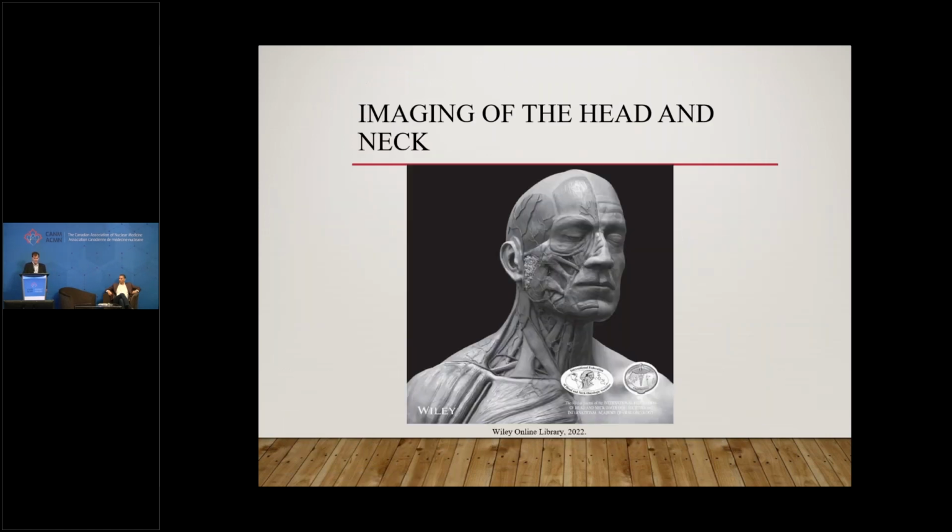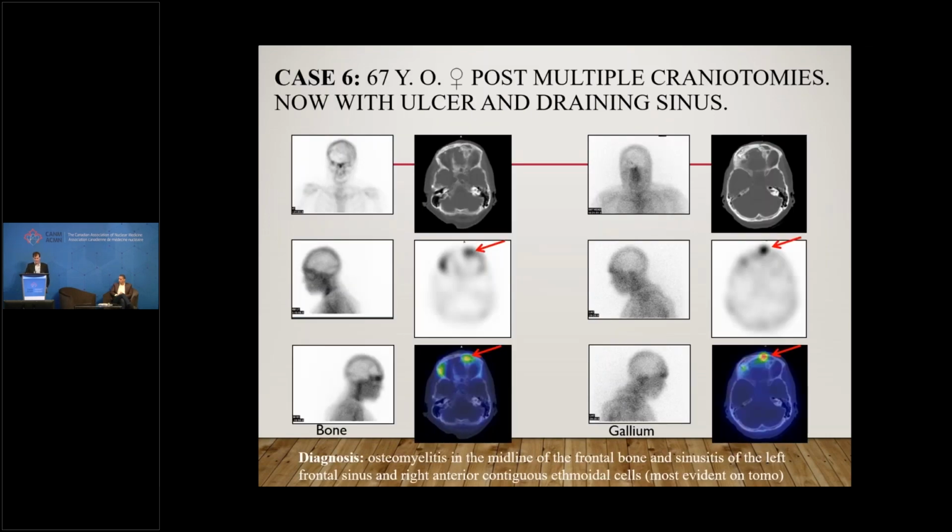Okay, now we're leaving the feet. Now we're going to the head and neck. The skull is actually a very challenging structure to assess for osteomyelitis, particularly in cases with multiple surgeries.